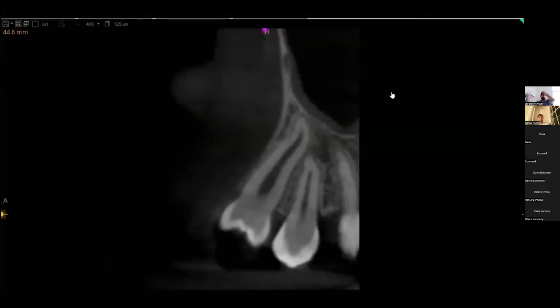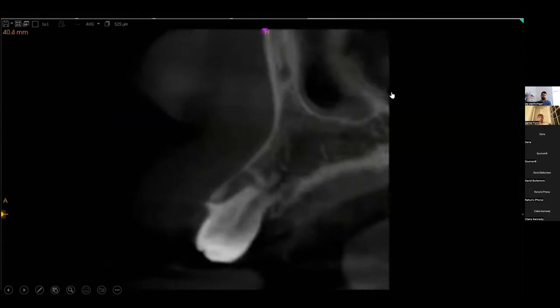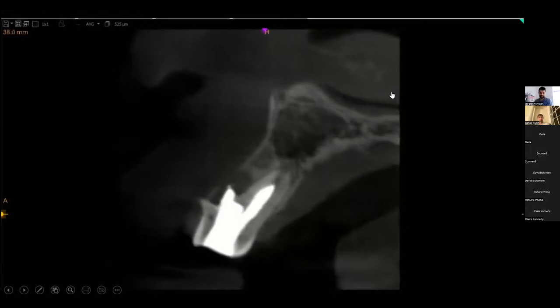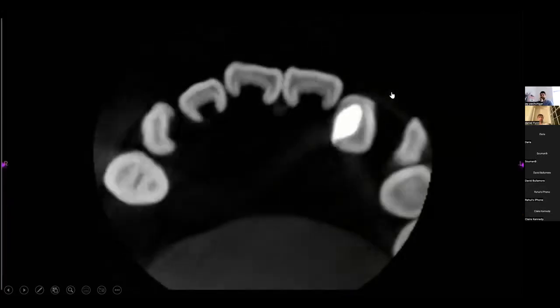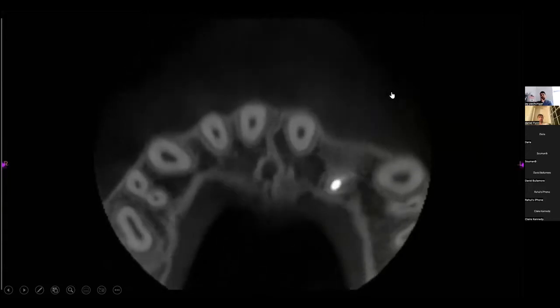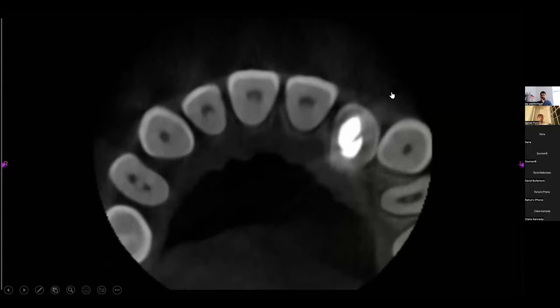And the orthodontist took a CBCT follow-up for me because I think they want to get braces on soon. So at the 6-month review, it's almost all completely healed. Yes, we've got a bit of extrusion over here, but it's very much easier to fill these big wide canals all the way through with these bioceramic materials, rather than trying to get GP in and your resin base. So yeah, I slept a lot happier knowing that there's bioceramic material in this tooth. It does make things a lot easier.